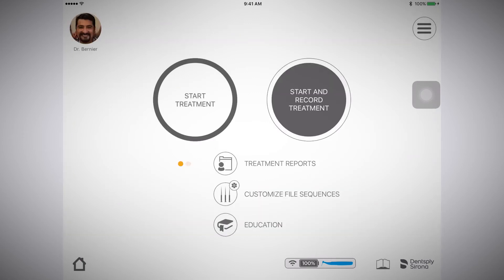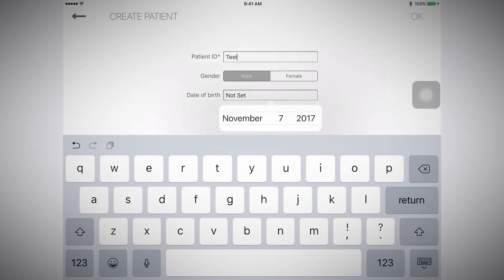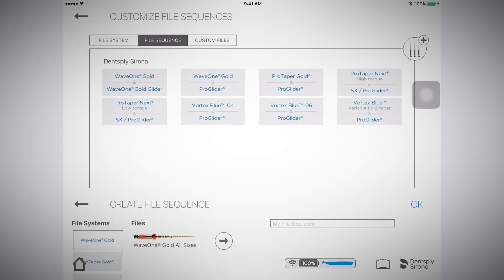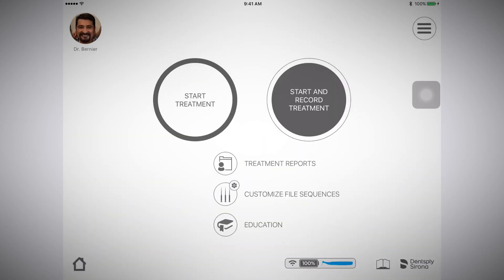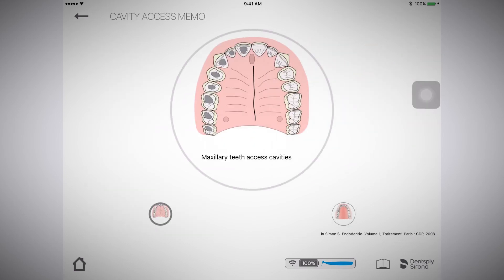In the middle of the home page, you will find treatment reports, customized file sequences, and education. The treatment reports section is where you can look up the patient and the treatment data that you've linked with that patient. Customized file sequences is where you'll create your customized file sequence or you can use a preset file sequence. The education section includes patient education, as well as education for you, the clinician.